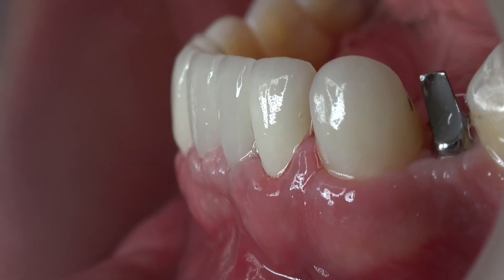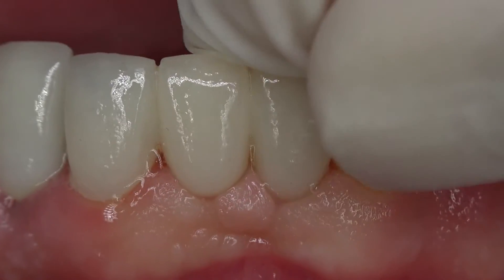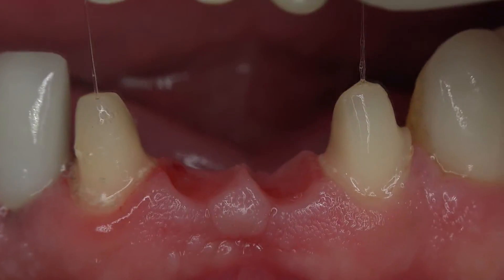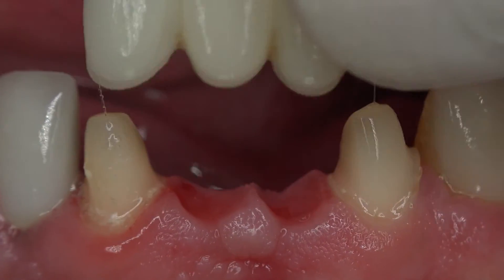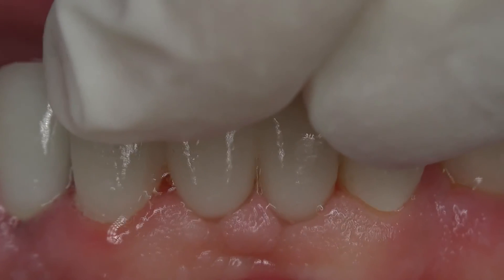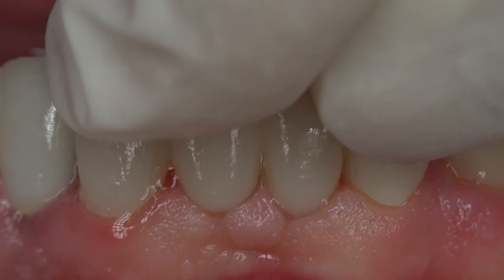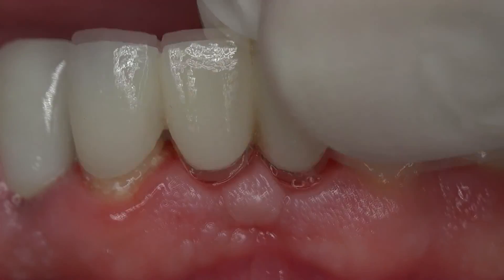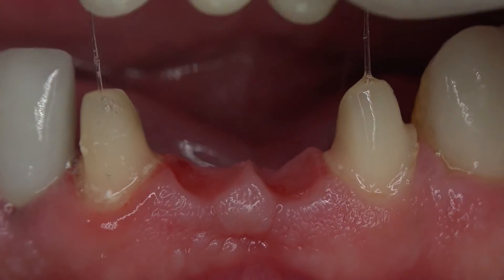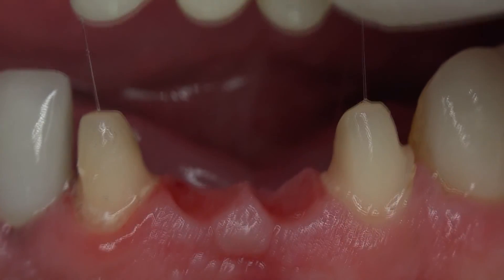At this stage, the emergence profile of the temporary restoration must be checked. After a four-week healing period, the patient is recalled, the prosthesis is removed, and the aesthetic outcome together with the healing process is observed. In this six-month delayed case owing to patient-related factors, it can be easily observed that the papillae height is gained, especially in between the pontic and the abutment teeth, instead of soft tissue loss.